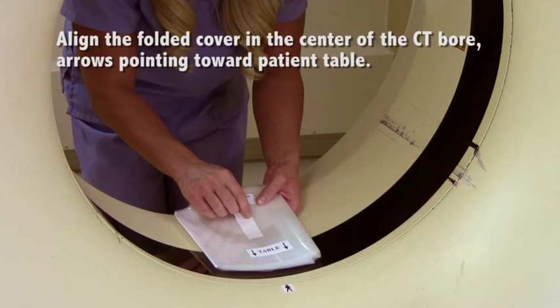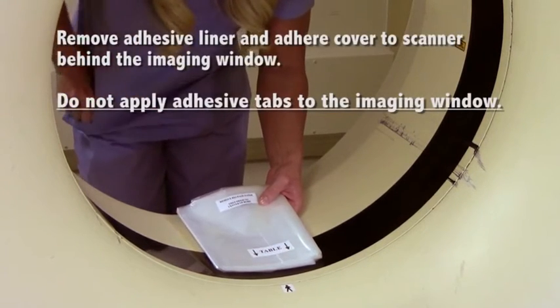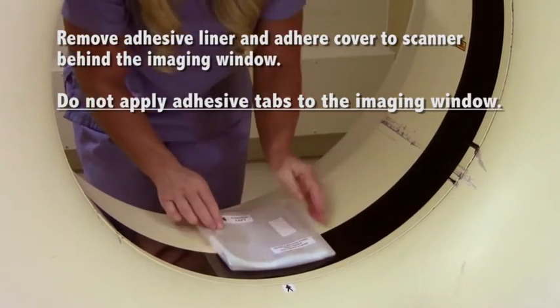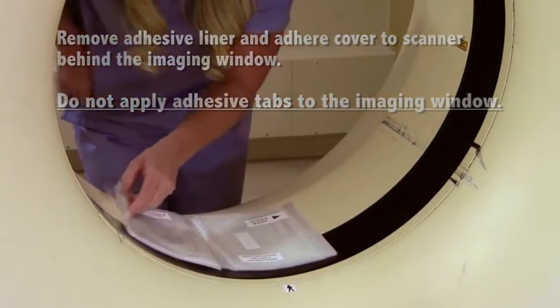From the non-table side, align the folded cover in the center of the bore with the table label arrows pointing towards the patient table. Remove adhesive liner, flip the cover over, and press adhesive tab to the scanner behind the imaging window. Do not apply adhesive tabs to the imaging window.